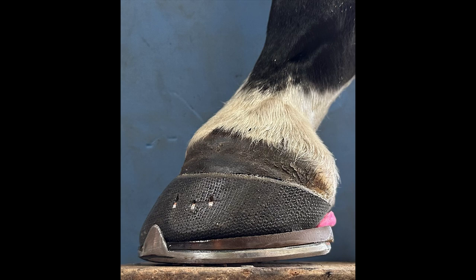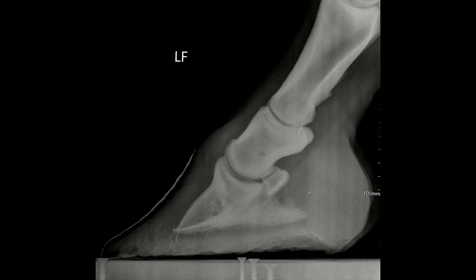This was quite a nice application of a low-grade roller shoe, which are a good option for mild to low-grade chronic laminitic horses like this one.